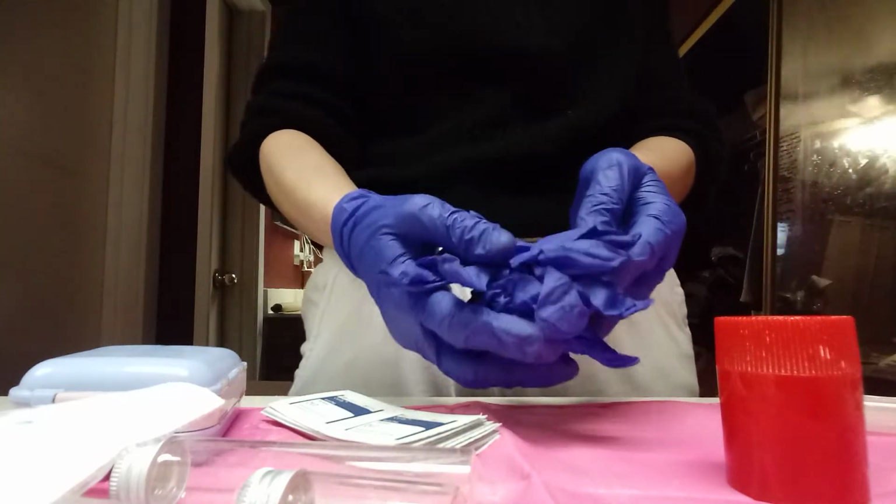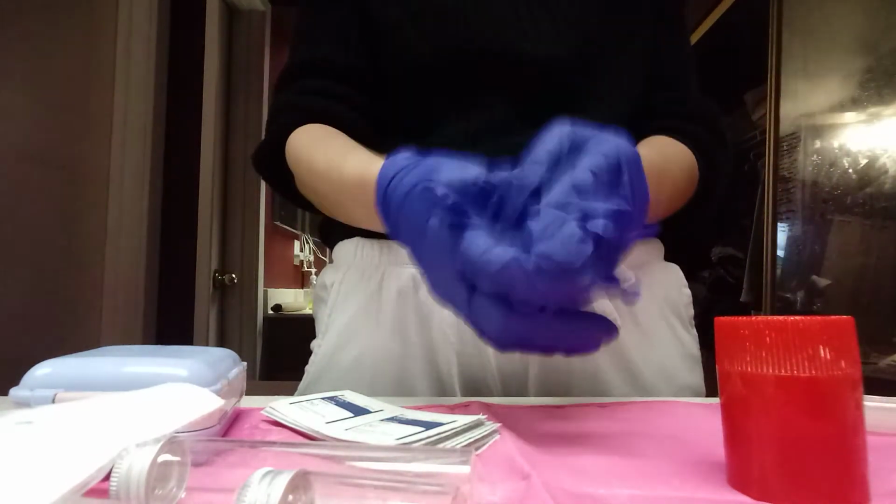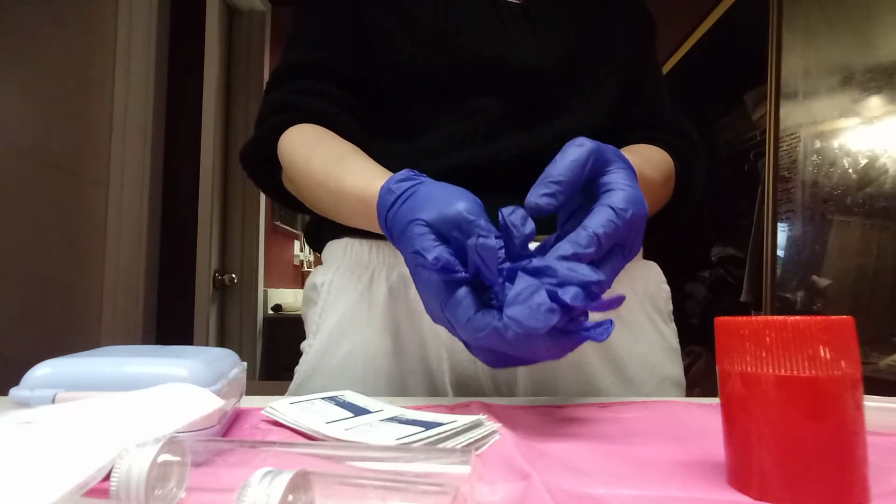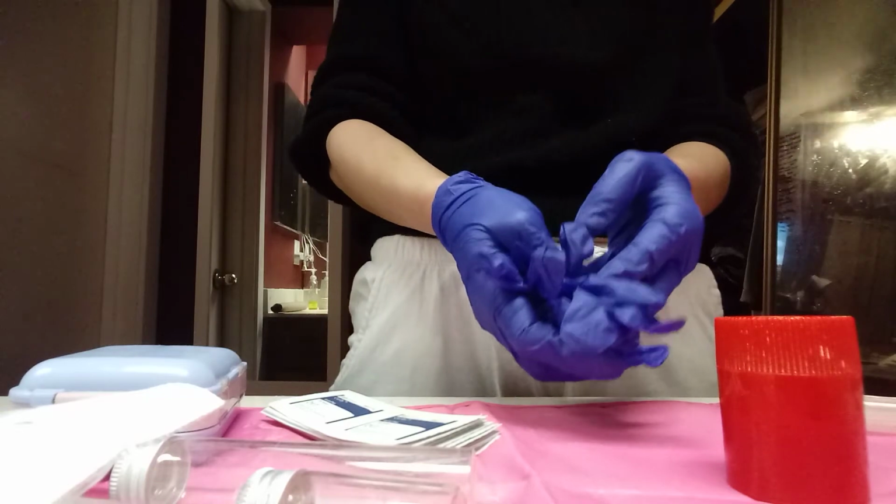Gloves, super important. Bring gloves with you. Don't do it without gloves. You will contaminate your PICC line and get an infection. I've been there. That's why I'm doing this video. It was horrible. Okay?